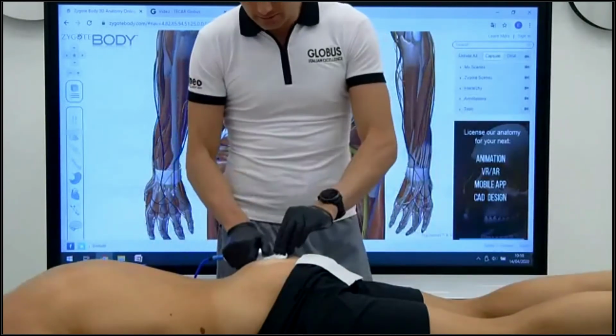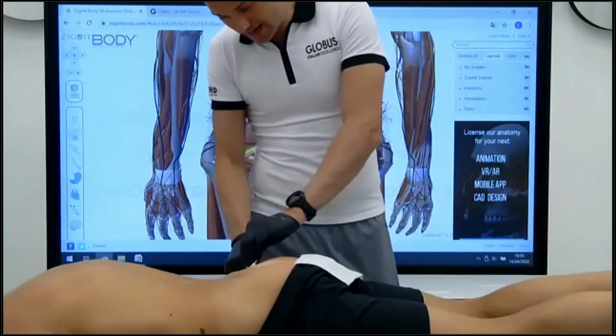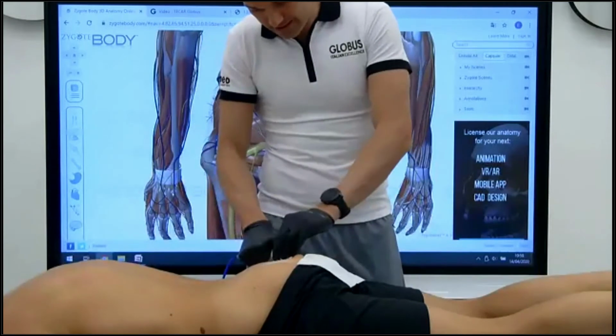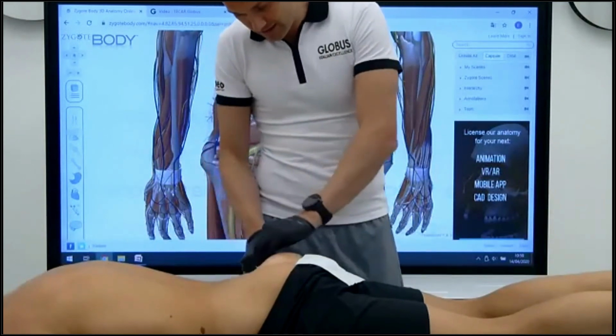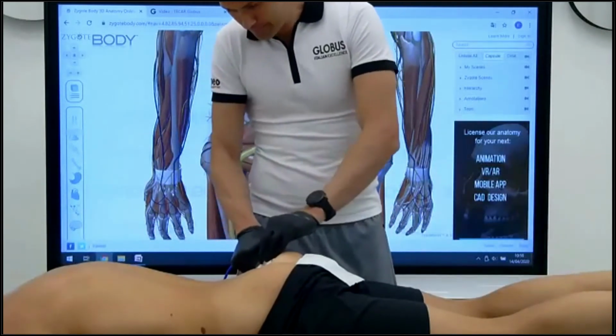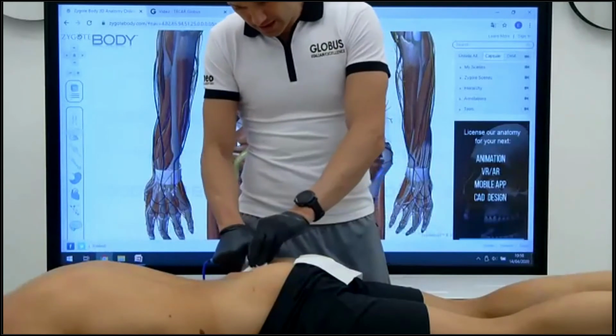In this way we are very safe in perceiving the tissue and relaxing it, especially the bands that are very, very stiff, and it is also gentle for the patient. He described a 6 between 0 and 10, so I think it is a good way.